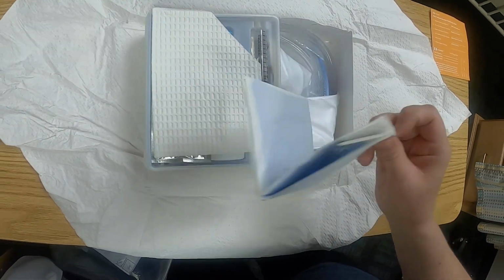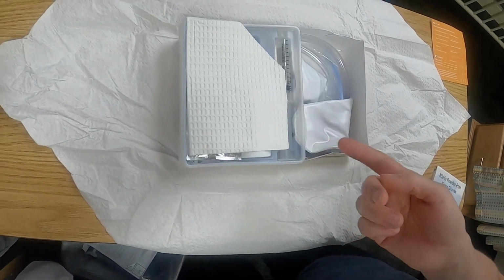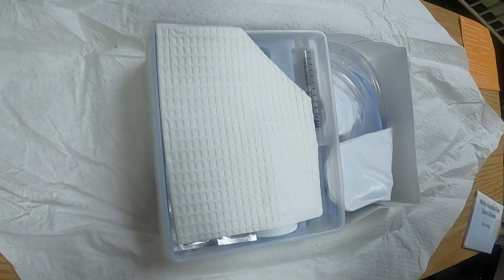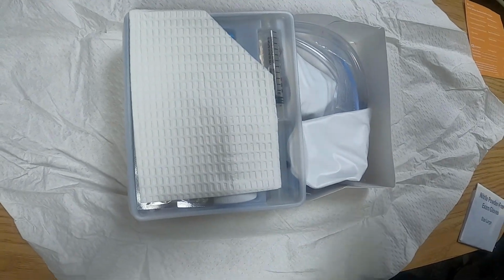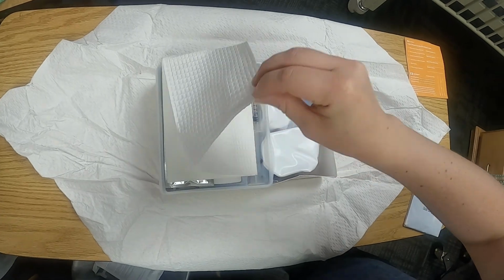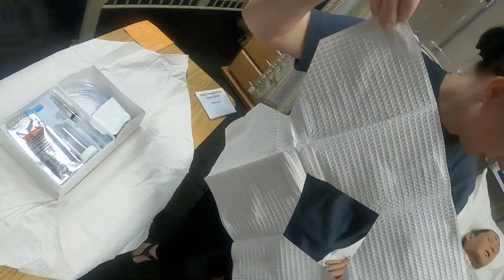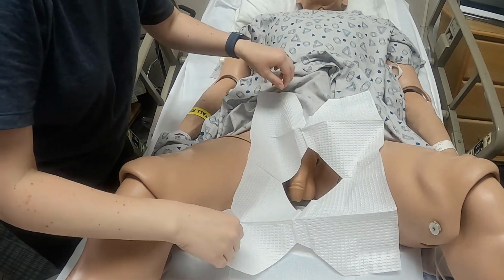The next thing that you see in here is your sterile gloves. We'll pick this up and put them on the side. Okay, that is a fenestrated drape. Yes, you can go ahead and put this on him. However, we noticed that especially if you're a student, oftentimes this is when it becomes a non-sterile drape, really. So you can attempt to put it on, or you can just leave it. Okay, so as you can tell, as you spread it apart, there it is.